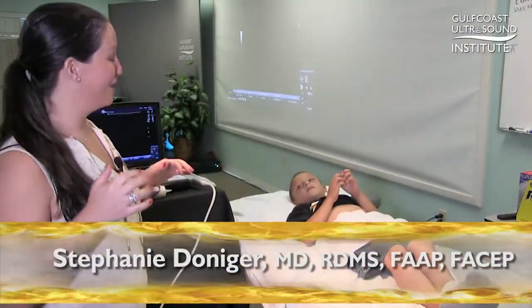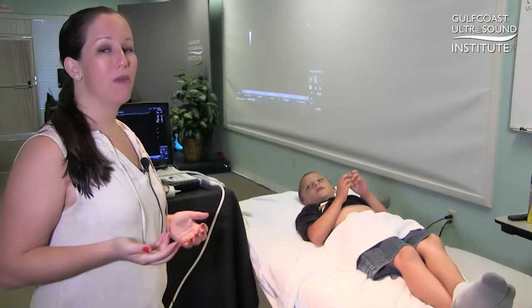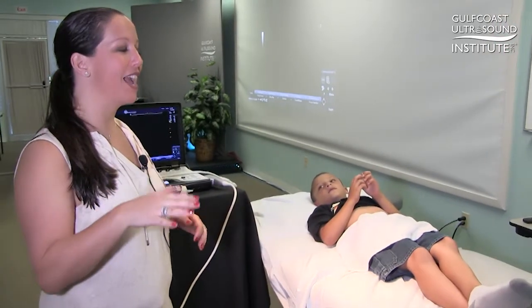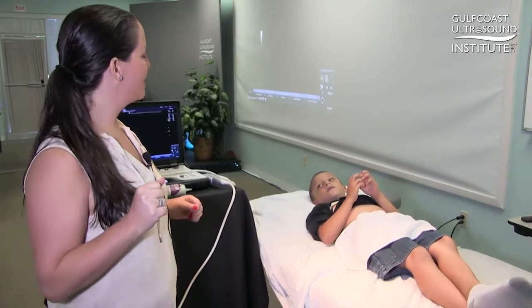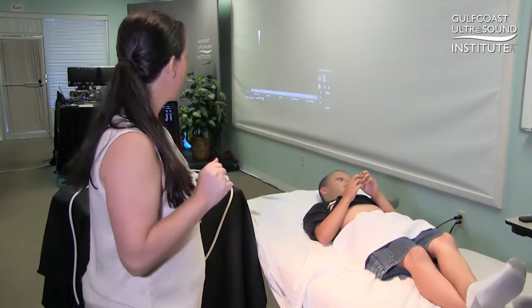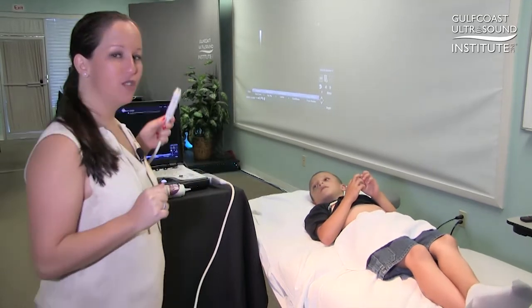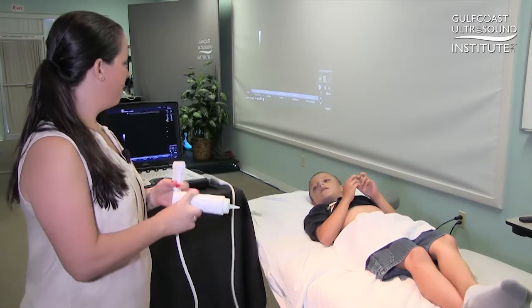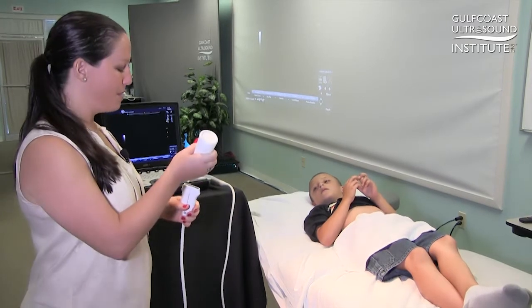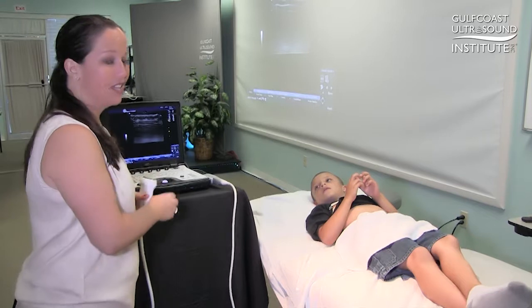We have the luxury of often having children come in with abdominal pain. We worry about appendicitis, so we often start scanning for appendicitis, but we may find unexpected findings. I'm going to start with the linear transducer to look for the appendix, put a nice amount of gel, and give pain medicine when indicated.